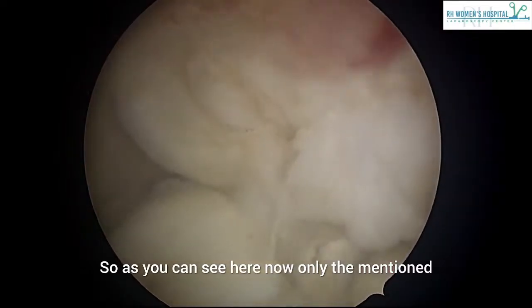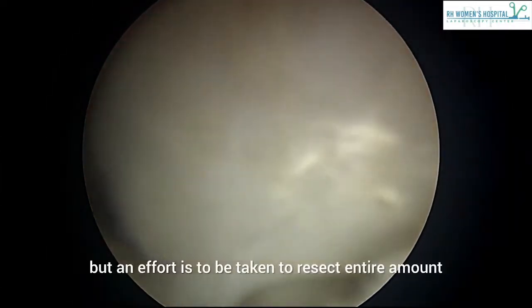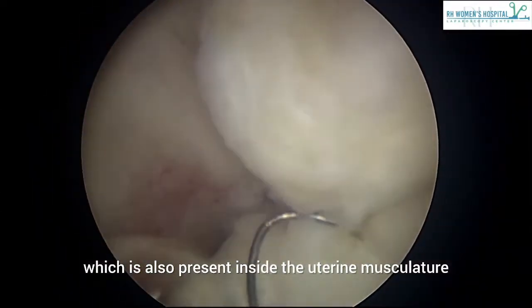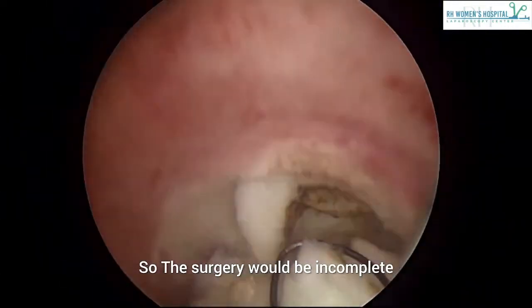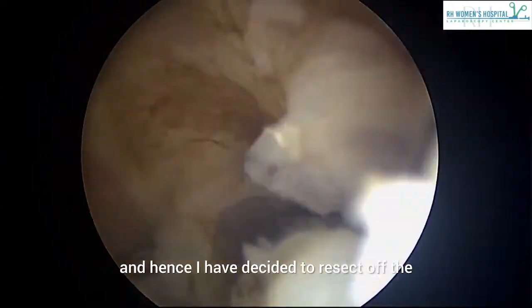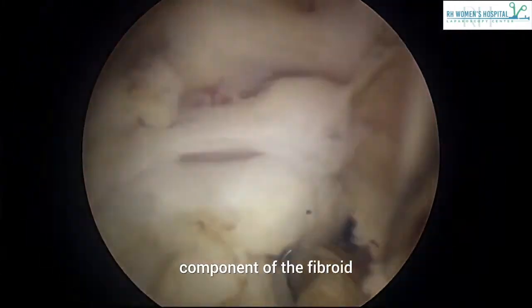So as you can see here, now not only the mentioned size of fibroid is to be resected, but an effort is to be taken to resect the entire mass of fibroid which is also present inside the uterine musculature. So the surgery would be incomplete if you do not resect the myometrial component of this fibroid, and hence I have decided to resect off the entire submucosal as well as myometrial component of the fibroid.